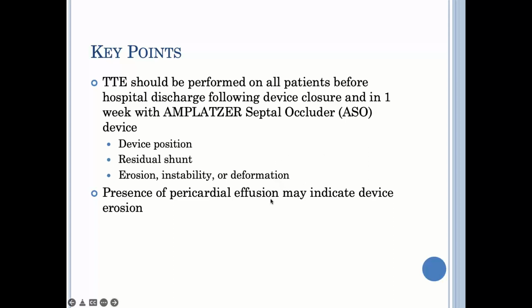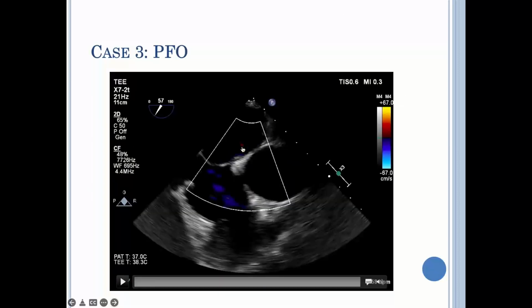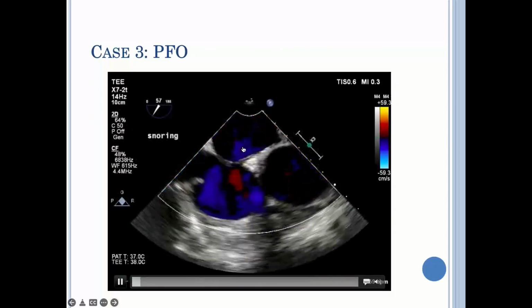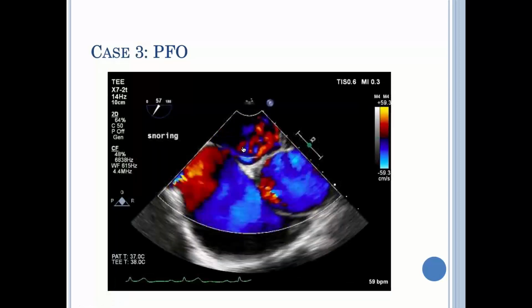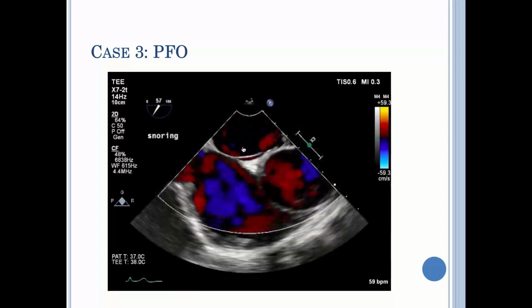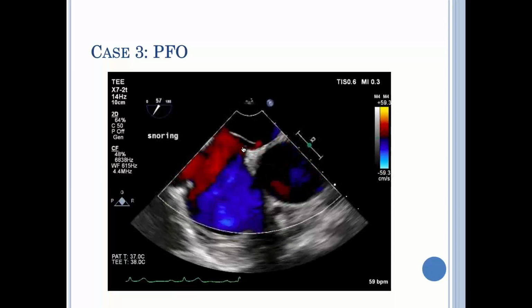So that's a good question. I think, again, it depends on your mode of assessment, but if you're looking at it with an echocardiogram, maybe I can bring up some of the videos. If you see that clear space where shunting can happen, but there is no clear defect in the membranes that causes a direct communication, I think you can call it PFO. And that's kind of what I would say.